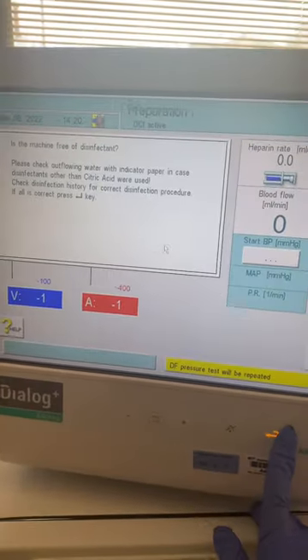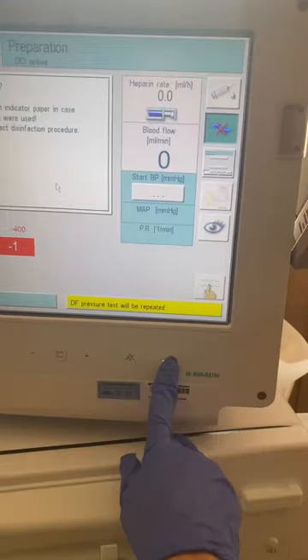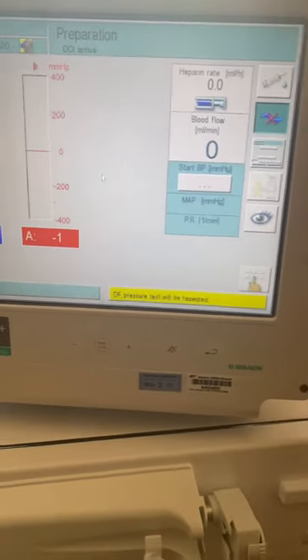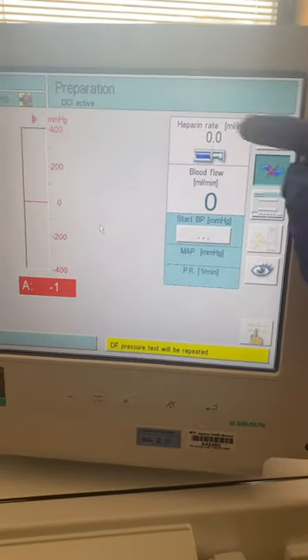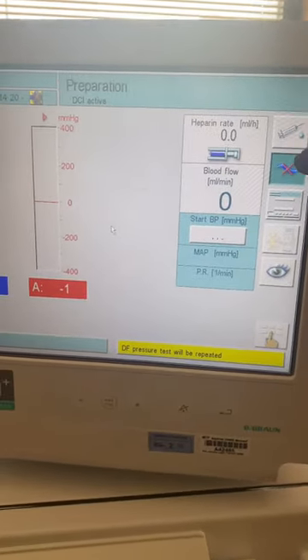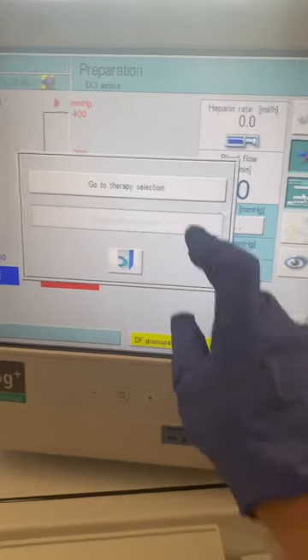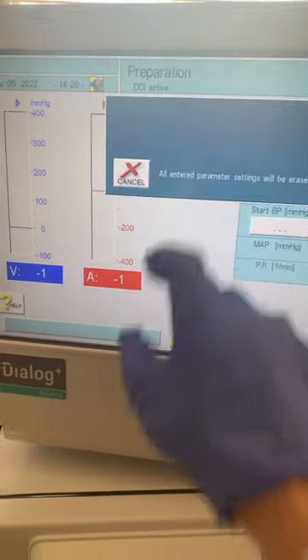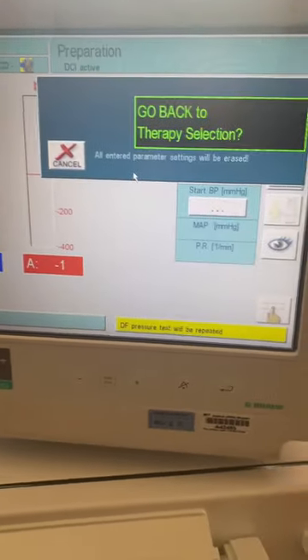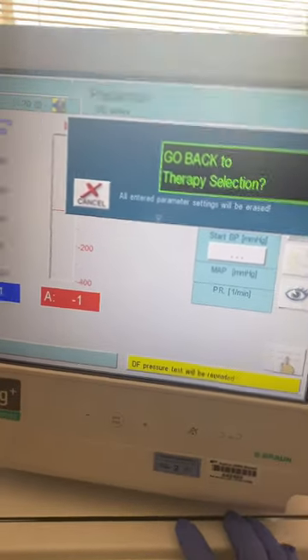This is the main screen when you come in in the morning — I'm just going to confirm. And now I need to go back a screen: one, two, three. So I'm going to choose that one. I'm going to go back to therapy selection. Yes, I'm sure — thank you for asking.